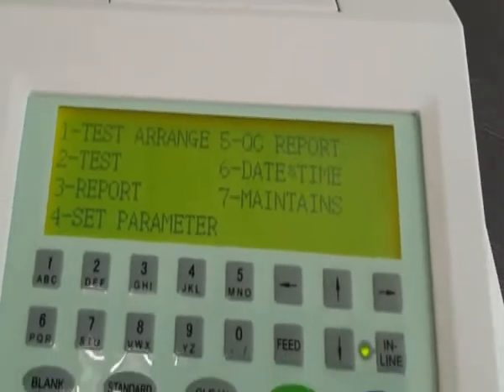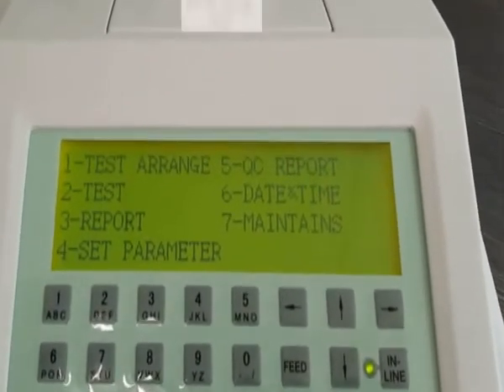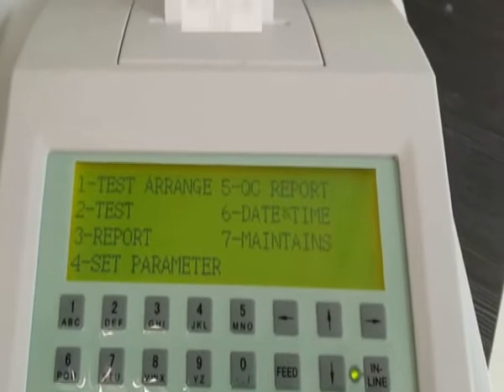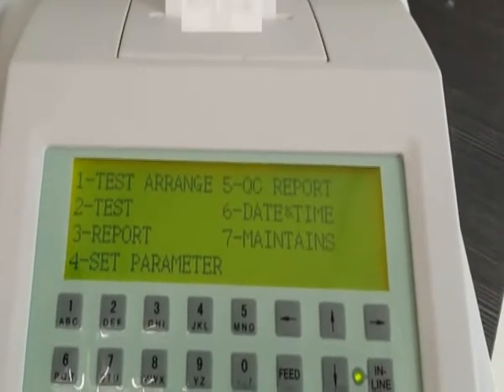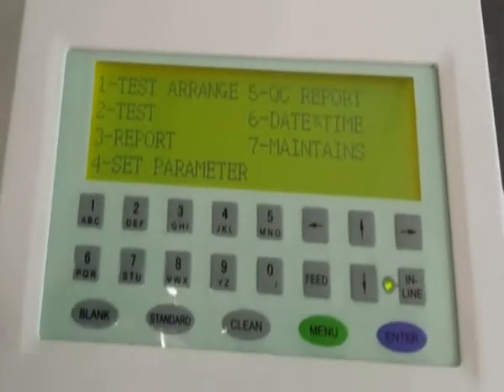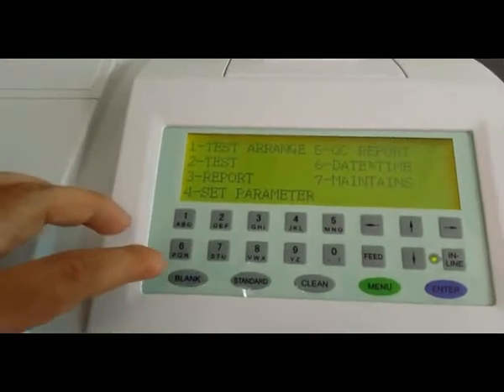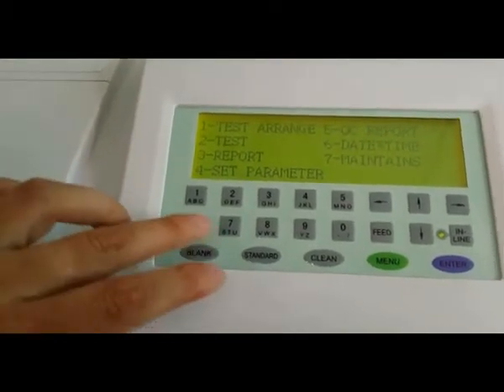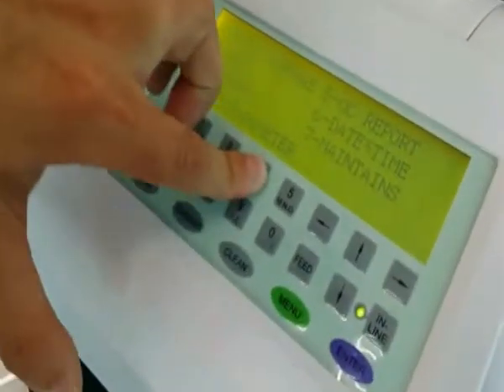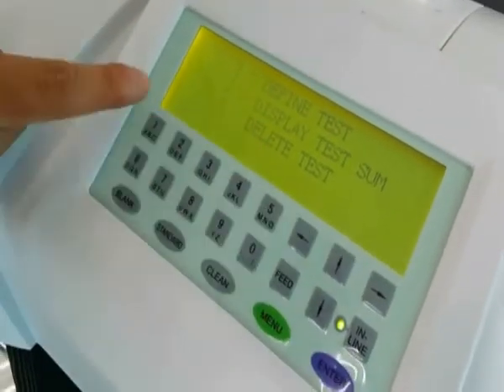When you enter the main interface, you should wait 5 minutes then start to use the machine function. First, we should set the parameter. So we choose 4 and 1.